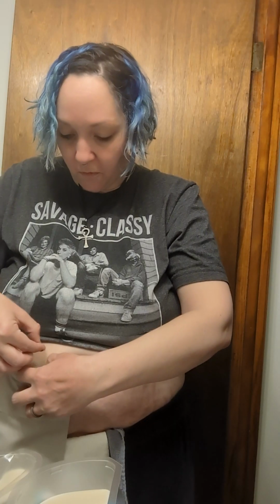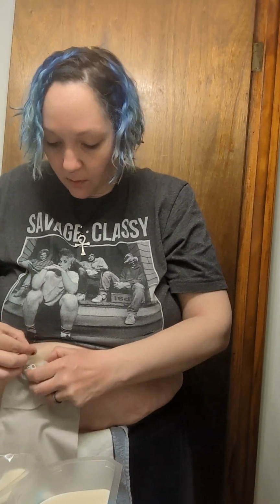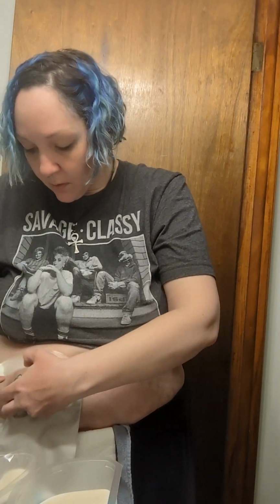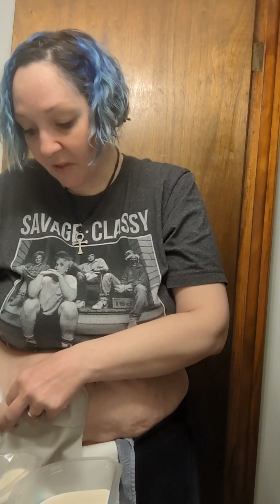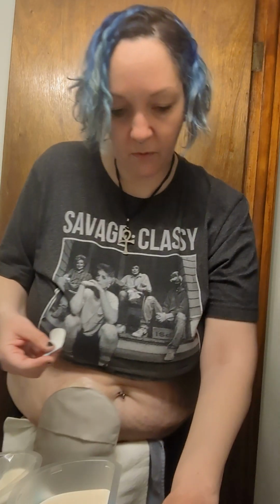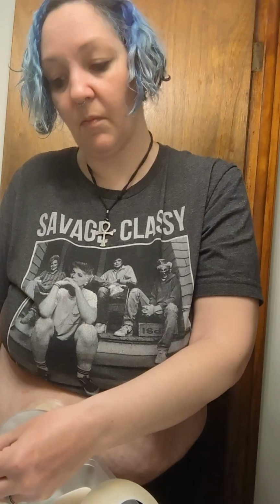All right, I'm gonna move my click tab over if I just could. Let's move that way. Okay. So why do I use different strips instead of just these two? That's probably a good question that people would have if you have a bag. Because this one, the original, sticks the best. The extra large is great for underneath. And the Y shape is great for on top. But I actually combine them because I find that's my perfect.